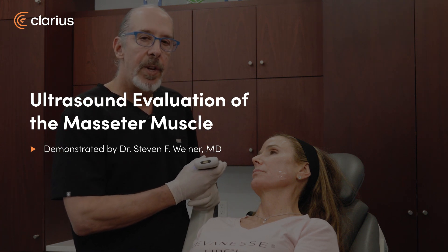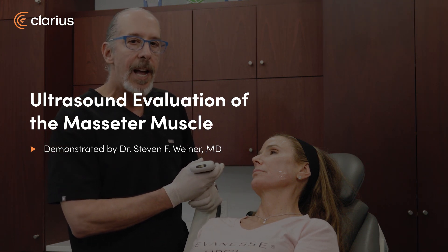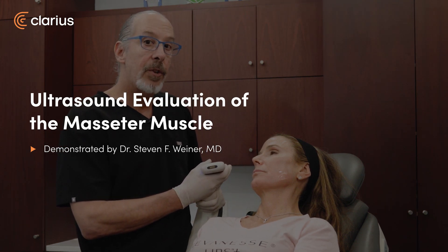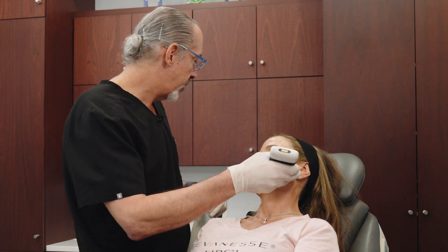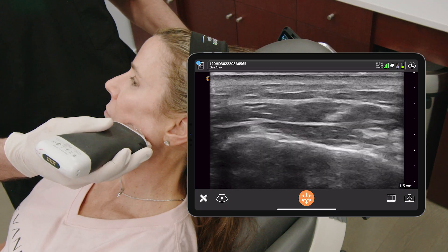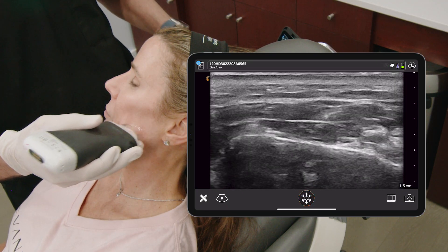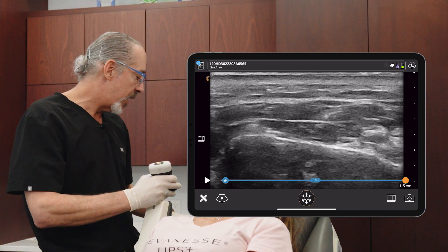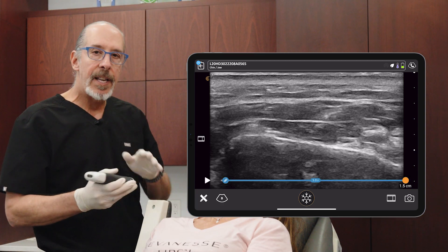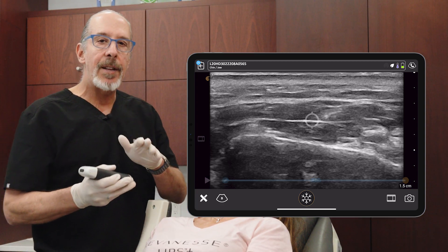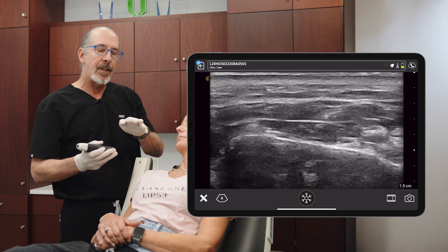I'm going to show you something within the masseter which is actually of clinical significance. I'm going to show you what's called the deep inferior tendon, DIT, and that's right here. So that separates the masseter — the deep and superficial portions of the masseter.